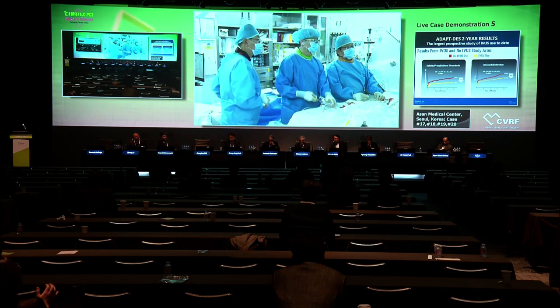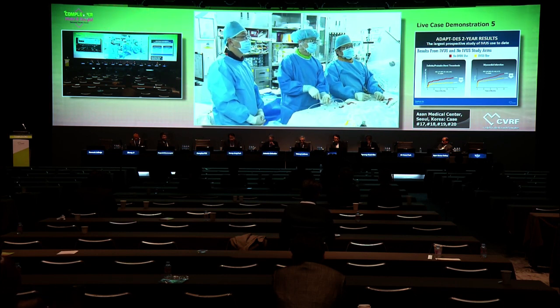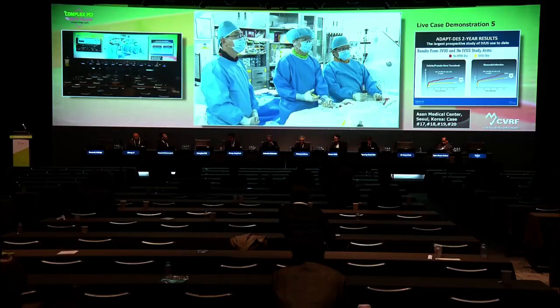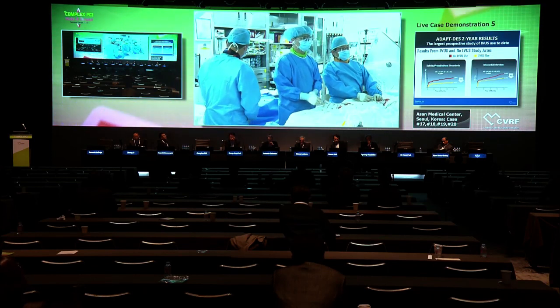Okay. Dr. Han, can you hear me? Yes, I can hear you. All right. What will be the last one? Dr. Jo, could you explain the... Yes, last one. Okay, I want to introduce this case.